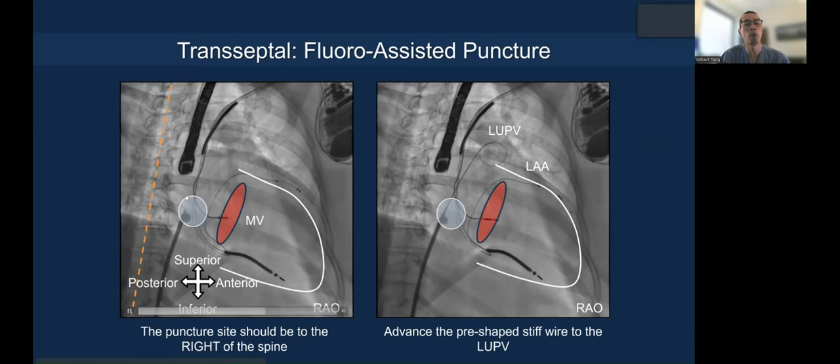You can see the wire go straight to the left upper pulmonary vein. If the curve looks a little different, the left atrial appendage is nearby, and sometimes the wire may end up in the left atrial appendage.